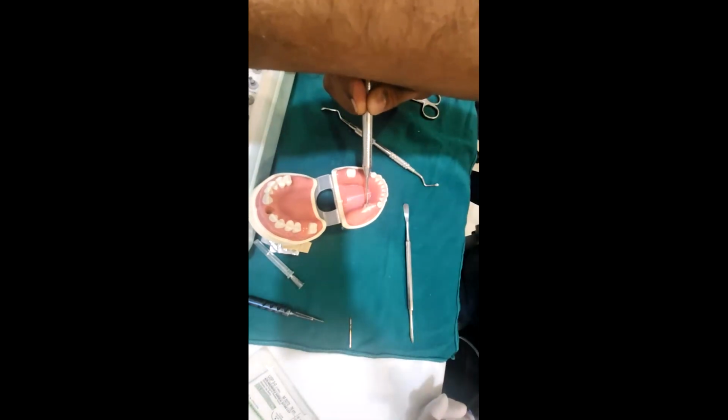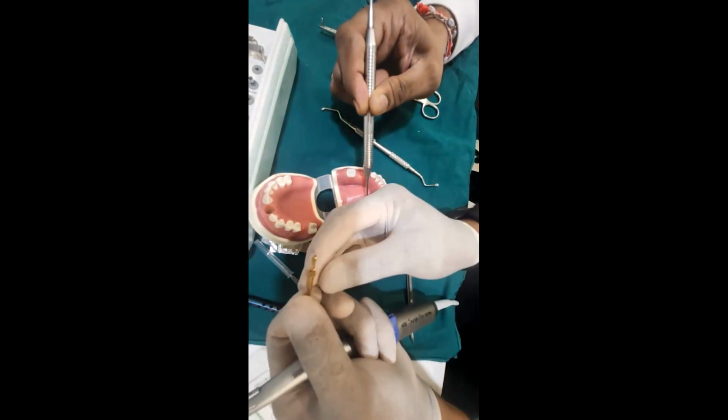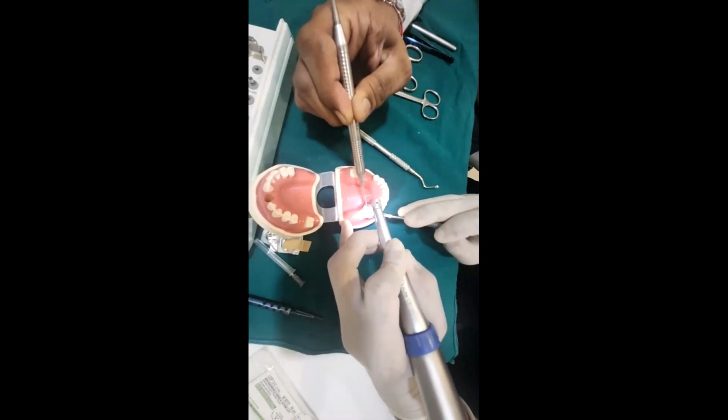After this, you will select the next drill. Come out with rotation.